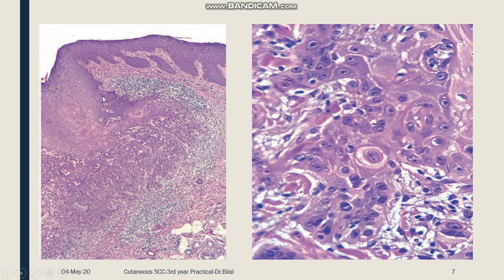You can see here in this area, a problem started developing. The tumor started here, and these all are the invasive tumor cells which you see in the underlying areas. So this part is still almost normal, and here we can see the invasive tumor cells on low power.